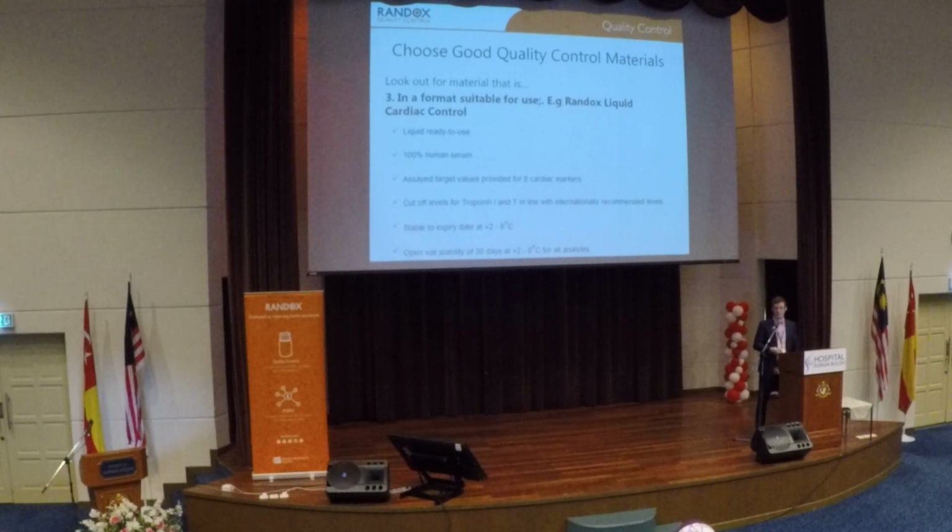Generally for hot countries, particularly like Malaysia, liquid frozen is not so popular because it has to be shipped on dry ice and has to be kept frozen at all times, which can become quite expensive to actually deliver that QC product. So lyophilized or liquid ready to use would probably be the better formats for countries like Malaysia.